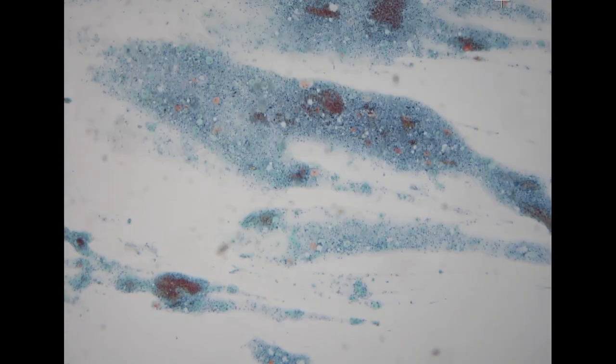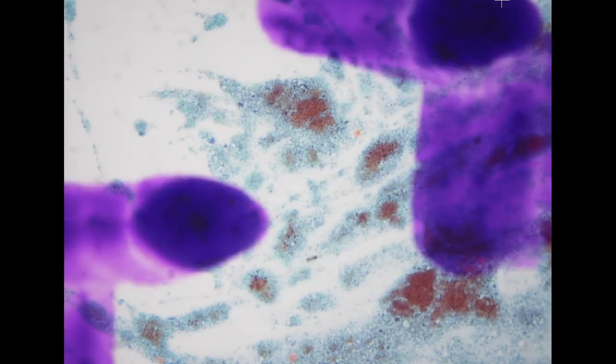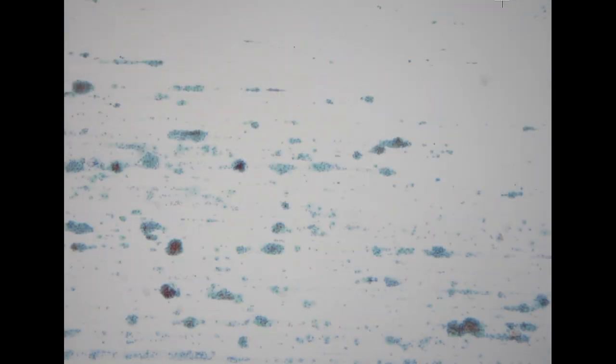And so for these elder patients, we would just call this atrophy. We don't need to call this ASCUS, especially since the patient already received a hysterectomy. So the original screener just put HSIL. This is a little bit over. The sign-out doctor downgraded to ASCUS, but I think we would be pretty safe to just call this atrophy. The patient had a prior screening smear last year in our hospital. We also sent it out as atrophy. So I think we just save this elder lady from more examination. So we just call it atrophy. So that is all the cases for today.